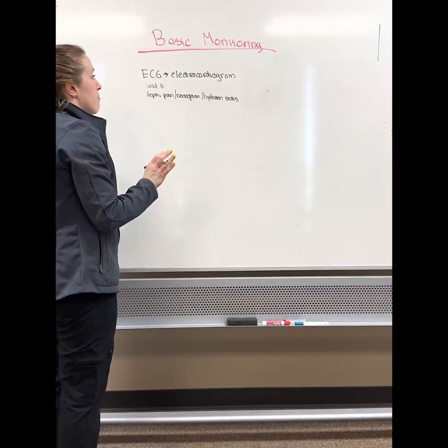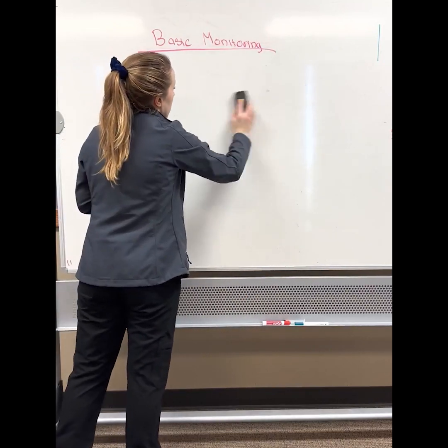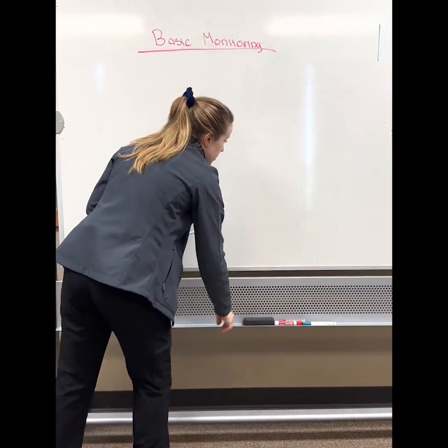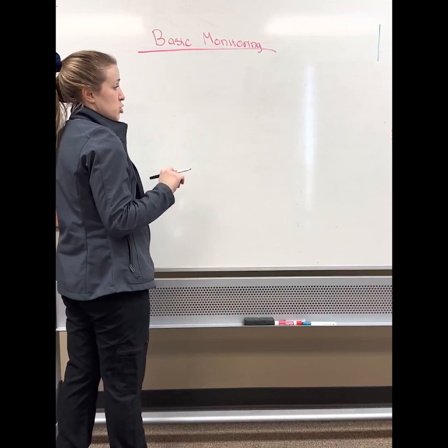So that's just kind of a basic look at ECG technology. It's based on Einthoven's triangle. It's going to give you some trends about how good the patient is feeling over time, but it doesn't tell you if they're alive, because pulseless electrical activity is an arrest rhythm.